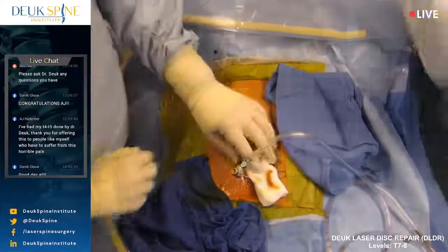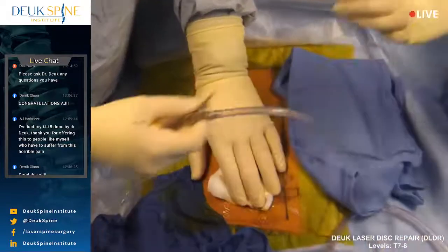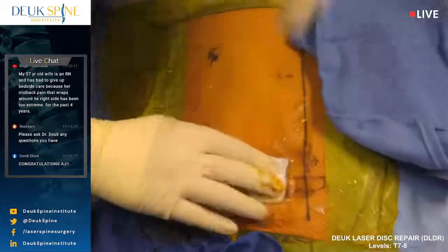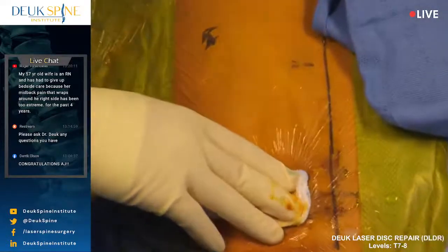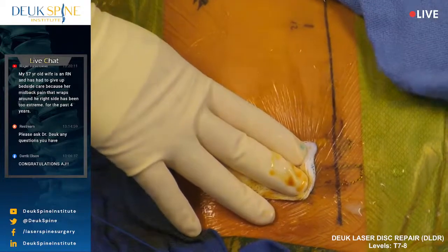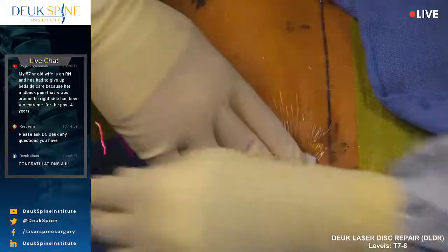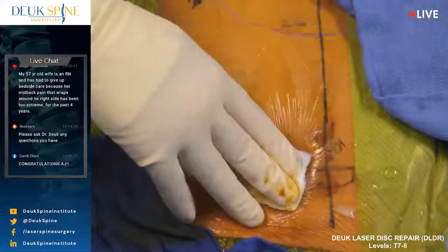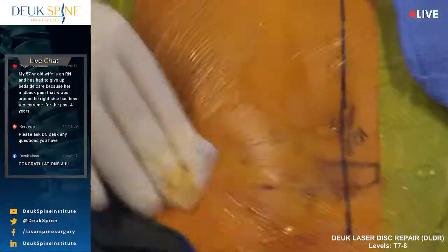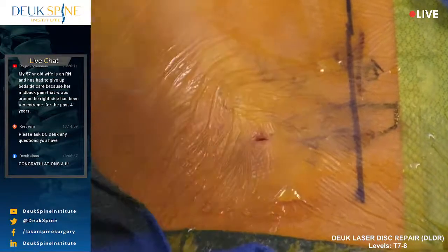All right, check it out. You guys see this, Diego? Yes, we see it. Done. We did the whole surgery through this little tube. Let's show you the incision. I'm just going to apply pressure for a minute in case there's a little muscle blood, a little ooze, but I don't think there is. I'm going to let Luis move everything here. I'm going to give you a nice view. We're all done. There's the incision. You all see that? Yes, we see it. 4 millimeters.